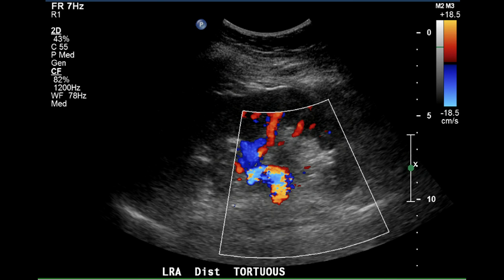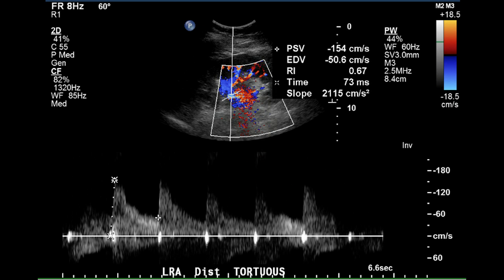The distal left renal artery appears to be somewhat tortuous as it enters the renal pelvis. The peak systolic velocity for this vessel is 154 centimeters per second, still well under the 3.5 times multiple of the aortic velocity of 94 centimeters per second. There is a normal resistive index of 0.67, a low acceleration time of 73 milliseconds, and a very sharp acceleration slope.